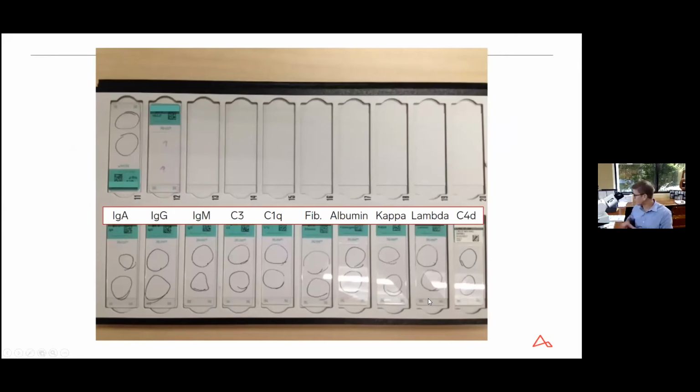Then in addition to the light microscopy, we will also receive a tray of slides for immunofluorescence. This was that second area that Denise just showed you. I'm showing you here a typical tray of immunofluorescence slides, and I've included labels of the different stains that are routinely performed. These slides have a very specific purpose; they're interpreted entirely differently from the light microscopy.